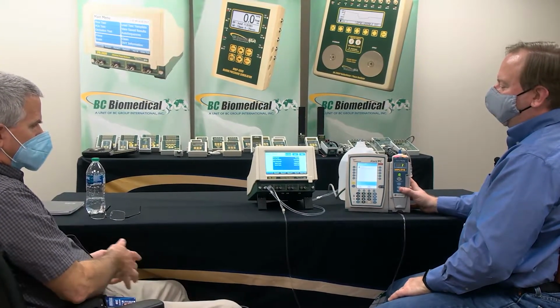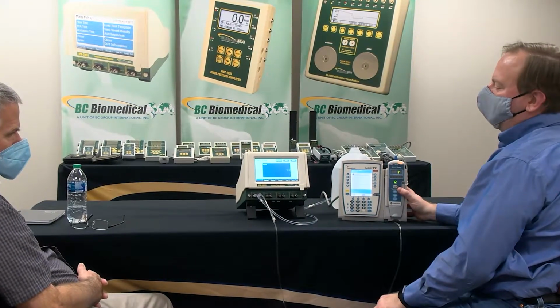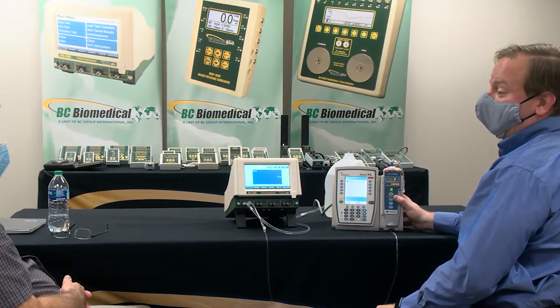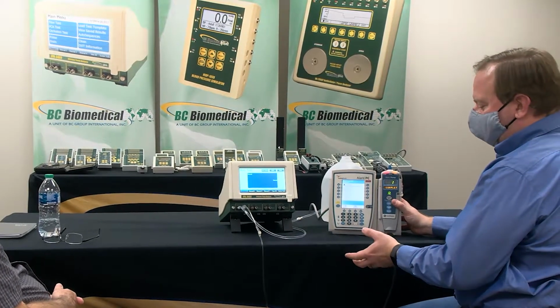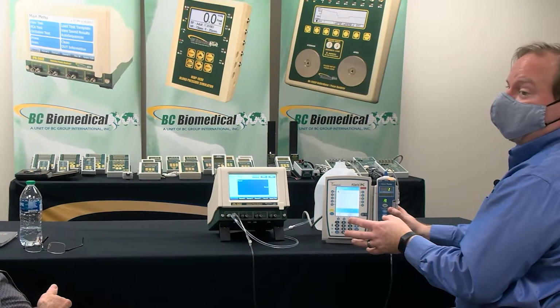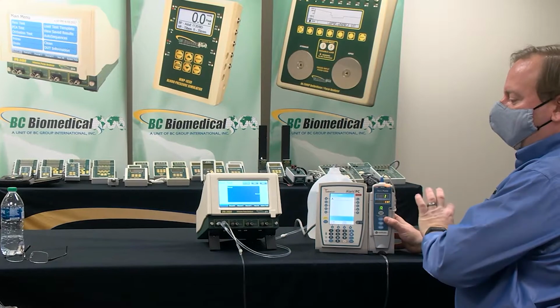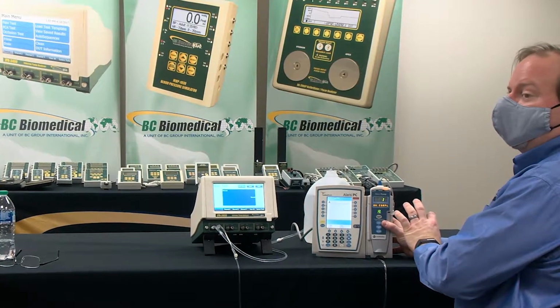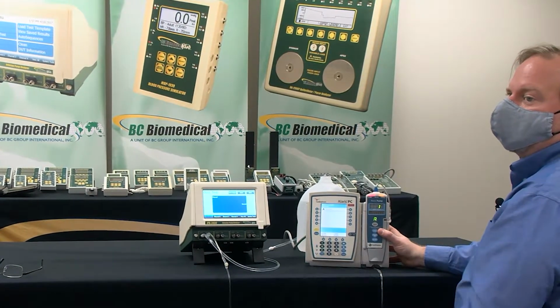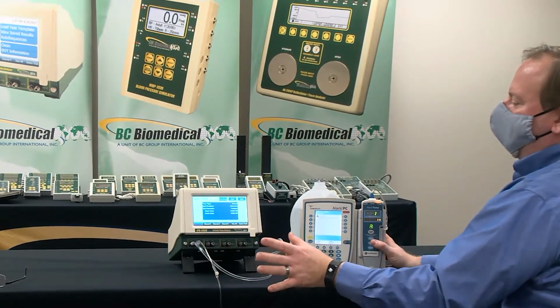The pump type is manual. We have a pump type setting in there. The idea is we could put in automatic mode where some pumps will auto reverse when they detect an occlusion. We haven't come across one, but supposedly it's out there, that when it detects an occlusion, it'll reverse the amount of volume that it put in so that it doesn't overdose. But we only have manual.